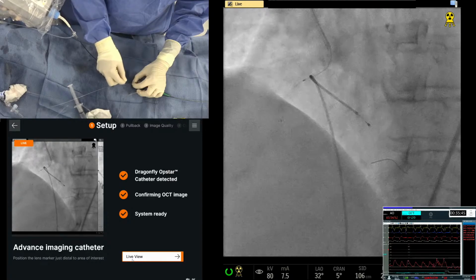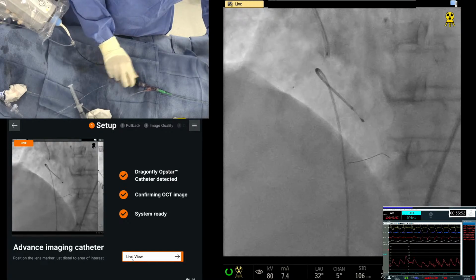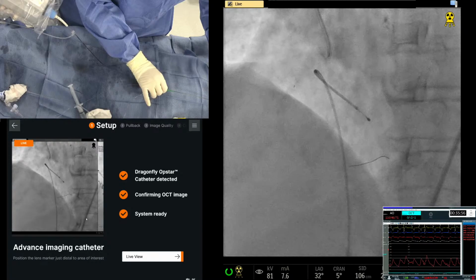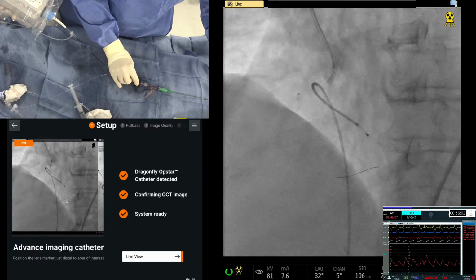Not the most supportive wire, and obviously a very short monorail. Would you consider leaving the rota and putting a different side-by-side wire? Run through, get us another wire.